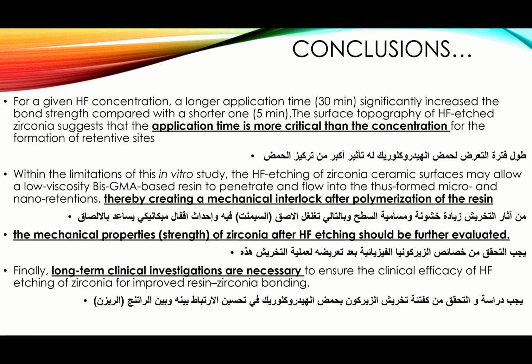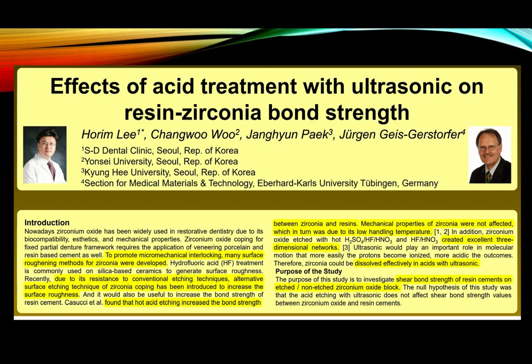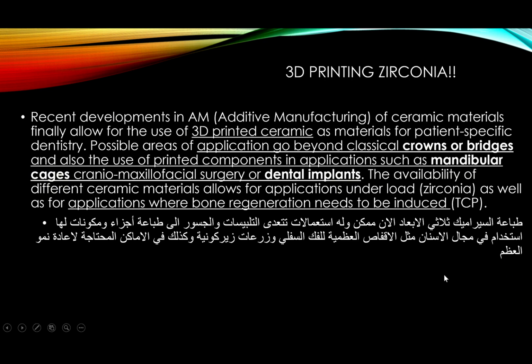But I've showed you the studies, and I've showed you what people rely on when they talk about surface roughening or etching of zirconia, the internal aspect and the external aspect of it, and that it will improve the bond with the ceramics from the outer part of the coping of the zirconia. You're talking about the interface of zirconia veneered or zirconia porcelain bond interface, as well as the inside, which is the resin cement, the resin interlock that is established with the inner aspect of the core, since it's been etched and surface roughened. Okay, so that's the issue of etching zirconia.